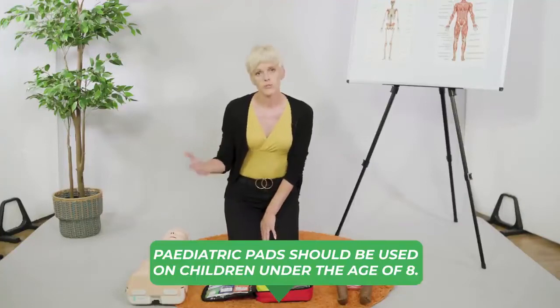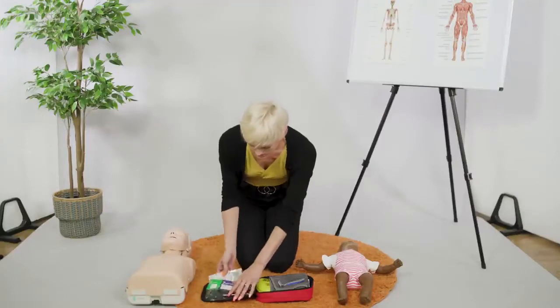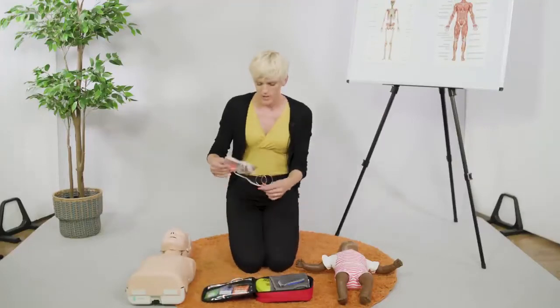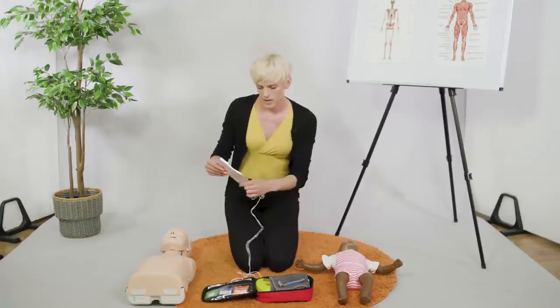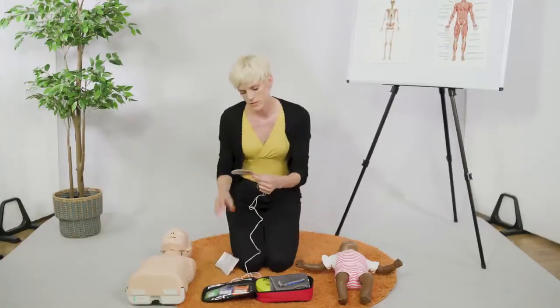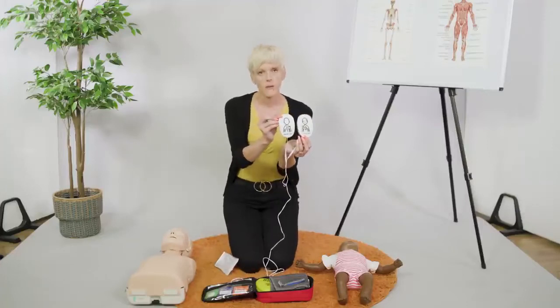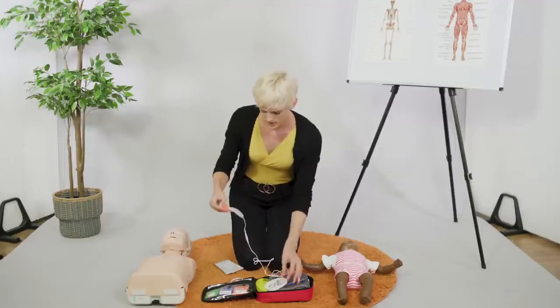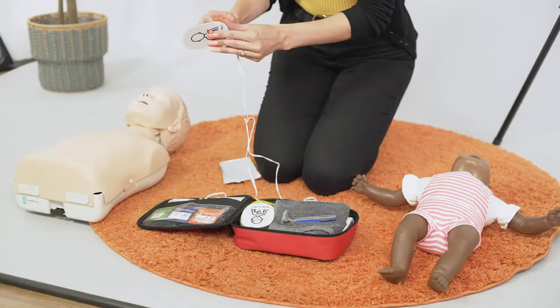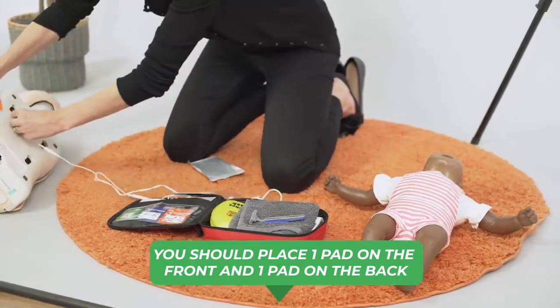From eight and above, we would use the adult pads. You would do exactly the same as before — turn the defib on and apply the pads as instructed. But as you can see, we are going to place them in a slightly different area. It tells us to put one on the back, and they can't have any clothes on — it needs to be bare skin.